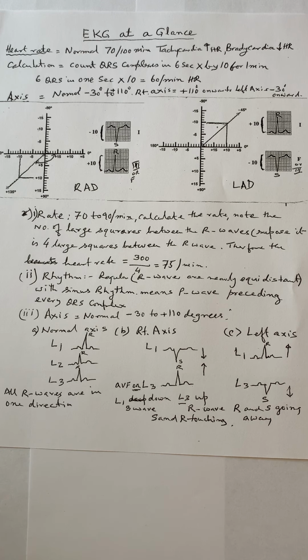If you keep normal in your mind, and you find the EKG you are reading is different, then you can understand the abnormality. You can go to the book and revise. So how to train your eyes for learning abnormal EKG? By looking at EKG records in various books, in strips, in hospital practice, or during monitoring of EKG.